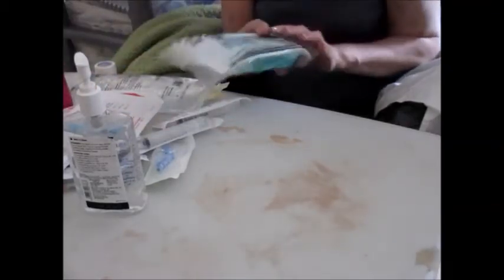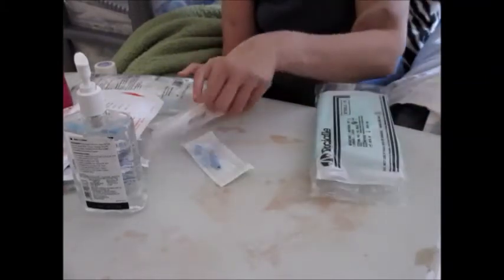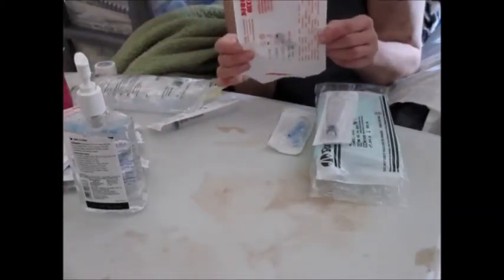In this part of the video I'm going to show you how I set up my dialysis table and what I've got on it. I've got one sterile pack, four 10ml syringes, a blue rinse connector which comes in the packs with the lines, my dialysis access needles — the fistula needles — and the size I use is 16 gauge.